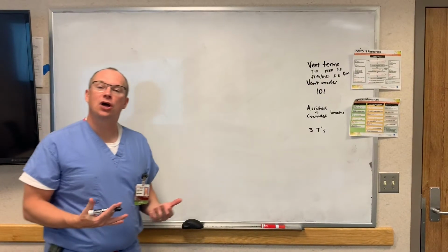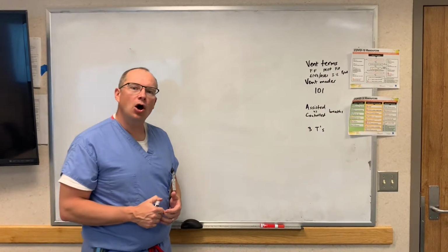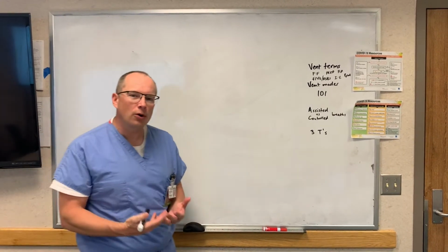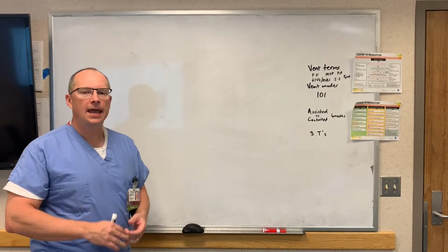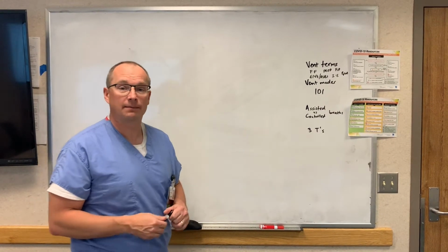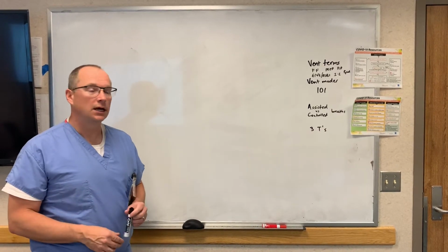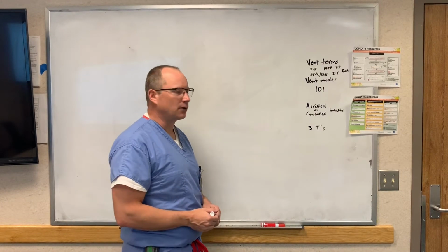All right, so now we're going to talk a little bit about some basic ventilator terminology and also some of the modes that you'll likely be encountering, with the majority of the patients being on a volume-controlled mode of ventilation, and then sometimes as they get nearer to extubation or trialing extubation, considering pressure support ventilation. That's about 90 to 95% of the ventilator modes we use around the medical ICU. And some may differ on that percentage, but I'm going to give that a rough estimate.